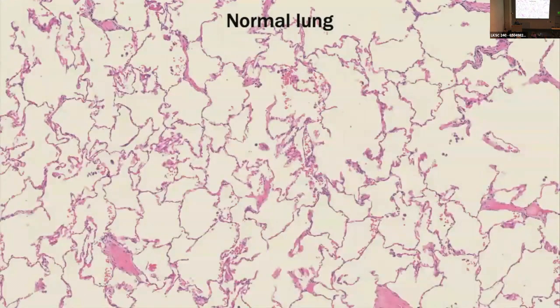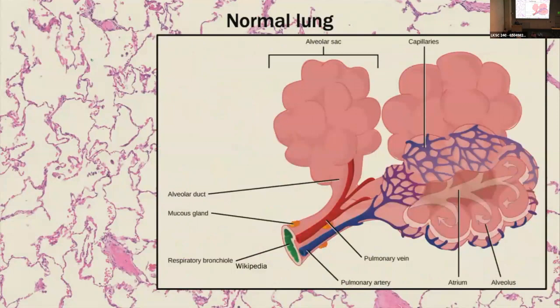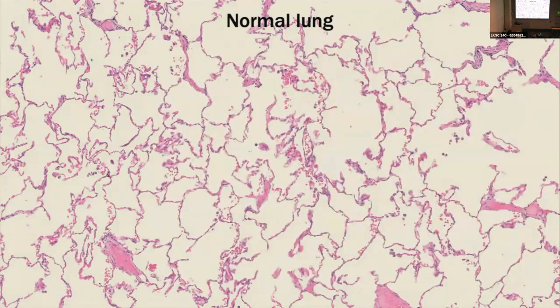All right, so this is the appearance of a normal lung, and its function is gas exchange. So it has a lot of these alveoli or air sac structures. Schematically, the pink things are the alveoli, and then they're surrounded by these nets of blood vessels. So the walls have to be very, very thin to facilitate gas exchange, so there's less distance for the gas to go from air into the blood. Aside from these alveoli, you also have these scattered blood vessels. Red blood cells don't contain nuclei. And when you have a mass of bright pink stuff within an oval, which is a tube cut in cross section, then you're probably looking at a vessel.